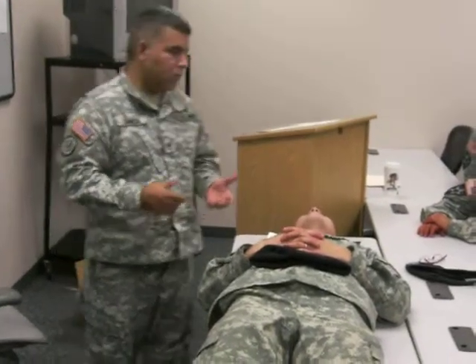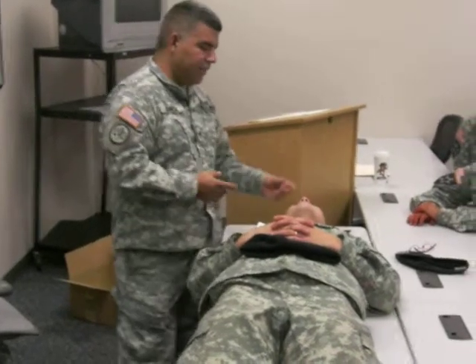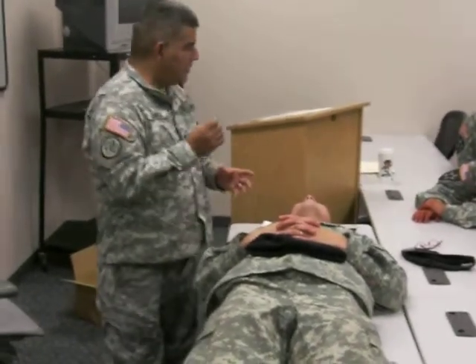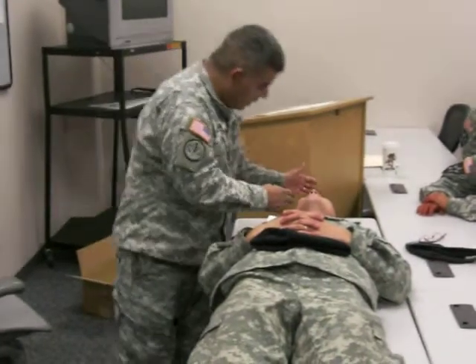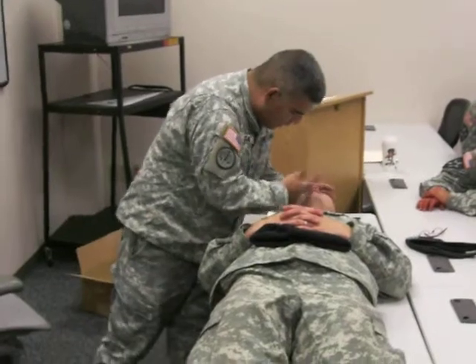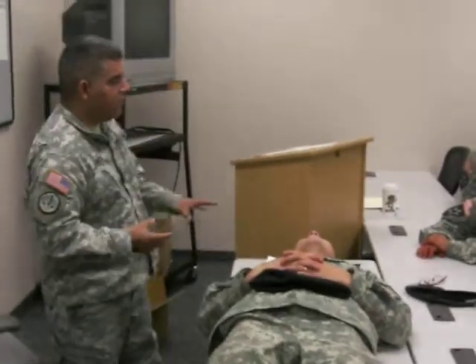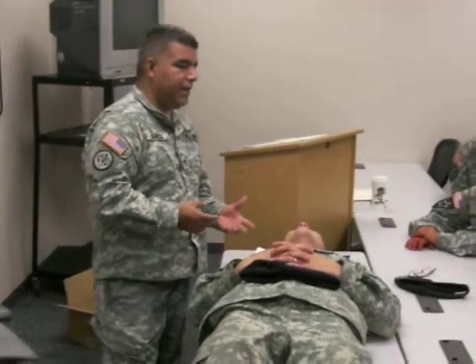Some other things we're looking at is the patency of the airway, of the nose itself. Patency means that it's clear all the way through. So as you look in, you can just look real quick, you open up the airway and you assess it. So you're looking at the roof of the mouth, inside the nose, inside the ears. If you see any fluids in any of those areas, you don't want to put in the NPA.